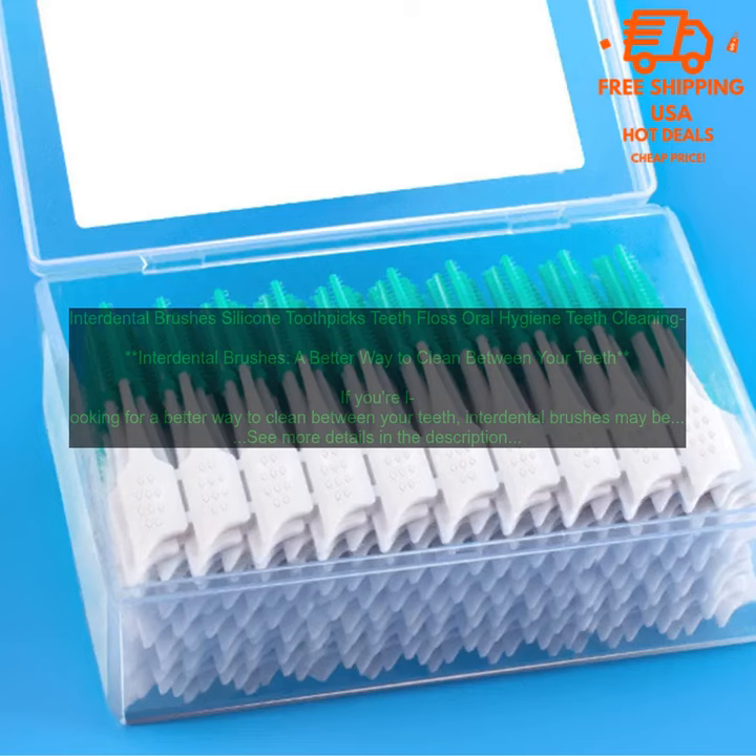Interdental brushes are available in a variety of sizes, so you can find one that fits snugly between your teeth. They're also very easy to use. Simply wet the brush and insert it between your teeth, then move it back and forth in a gentle, circular motion.